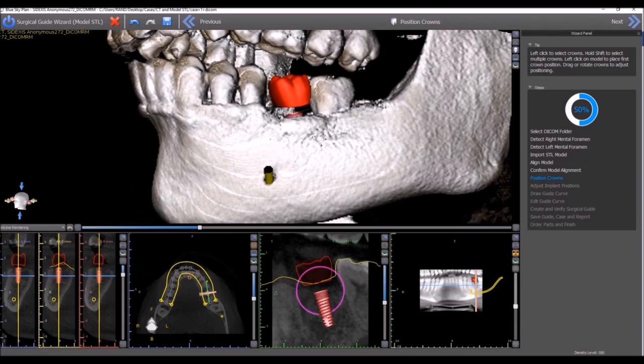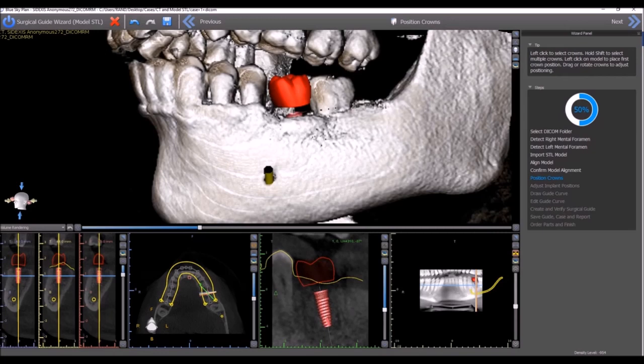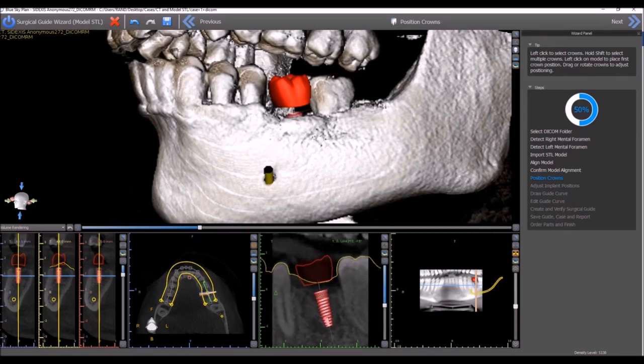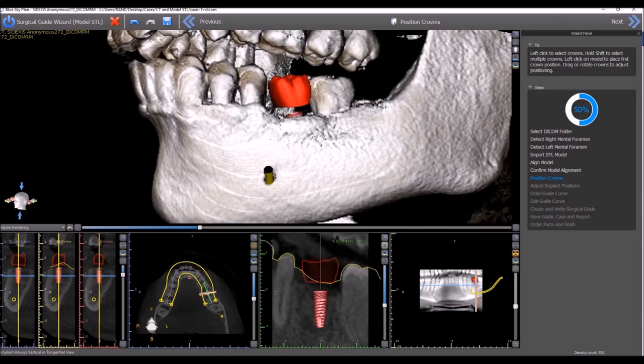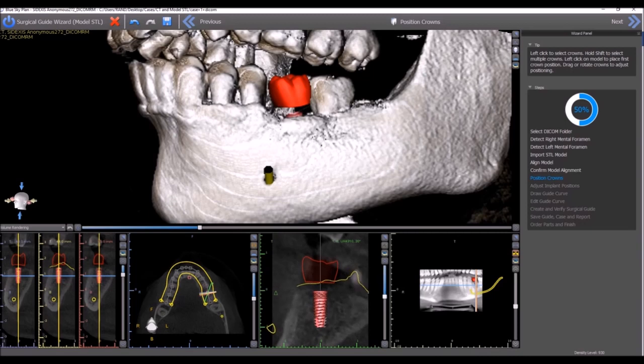While we're looking at our tangential view, the tangential view will show us 360 degrees around our implant. Let's discuss another improvement that we have with the tangential view. You can now click on the second icon from the top that will make the tangential view implant-centered with the implant remaining vertical the entire time.